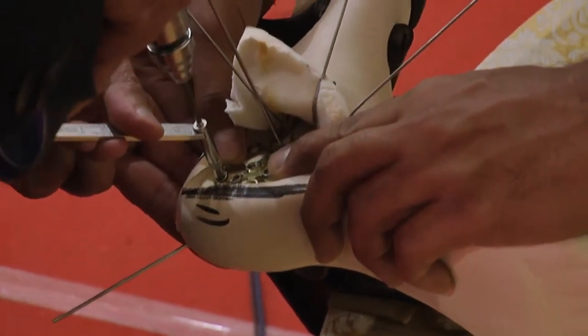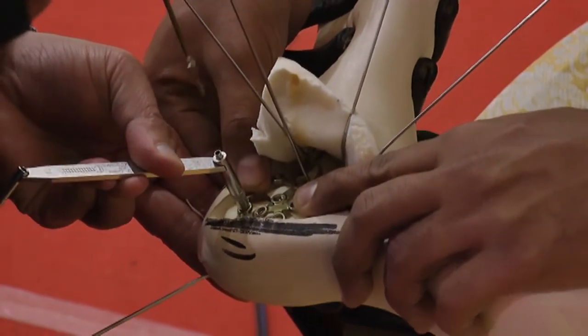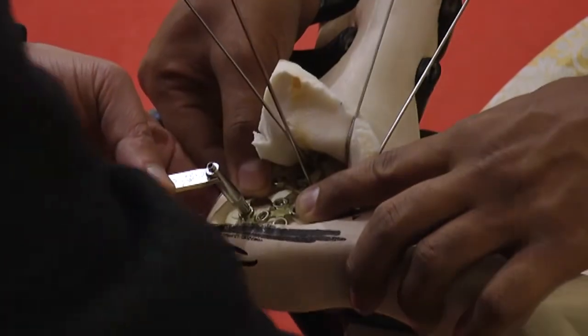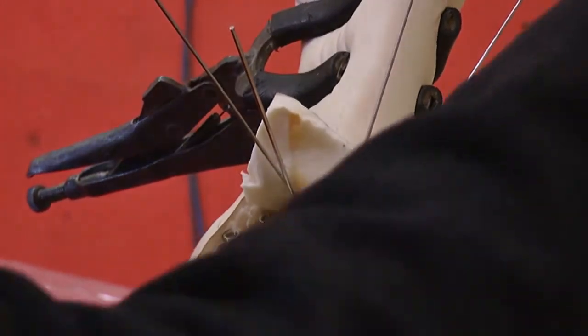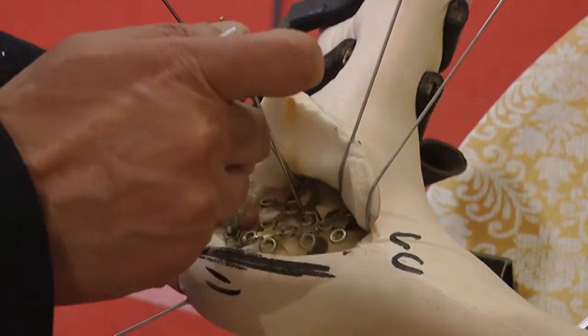So generally I use the woodpecker technique. The woodpecker technique is going like this, touching the bone every time you go forward, and then you use your depth gauge and a proper 3.5 cortical screw. So that's 30.